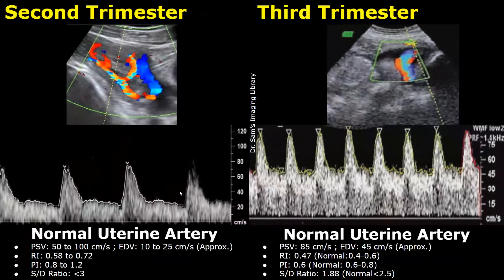These are normal spectral Doppler waveforms of the uterine artery in the second and third trimesters. During the second trimester, the uterine artery peak systolic velocity is usually between 50 to 100 centimeters per second, and the end diastolic velocity is usually between 10 to 25 centimeters per second. Keep in mind that these values are just approximate ranges — there may be some variations in some cases.